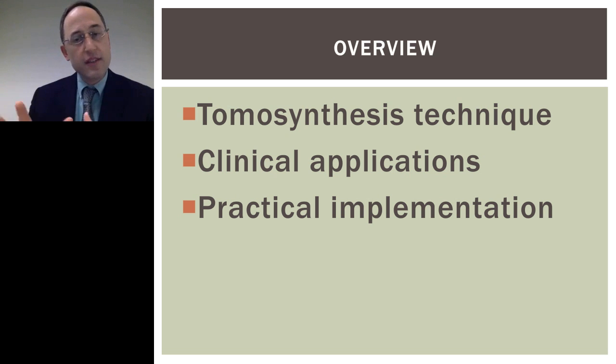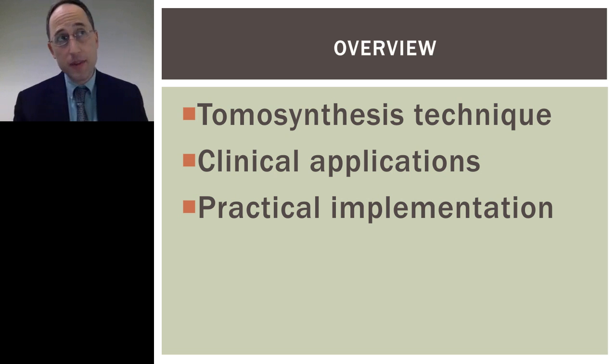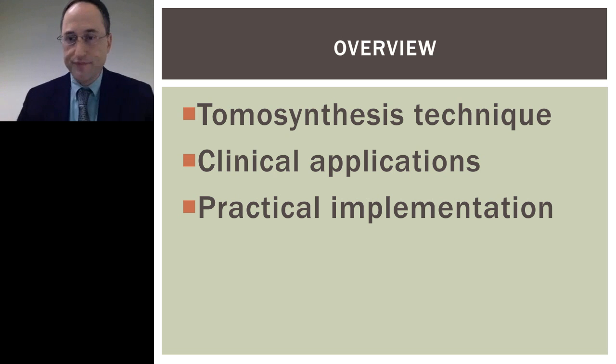And then I'm going to discuss practical implementations, sort of my personal view of how this could fit into your general workflow, and also what does some of the evidence suggest is a good way to make it fit into your workflow. And I'm also going to talk about what I think are maybe some barriers to implementing it, and things that I've just seen from my own experience with people accepting that modality here. Okay, so let's go ahead and get started.